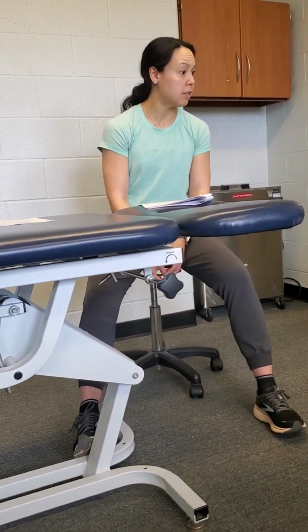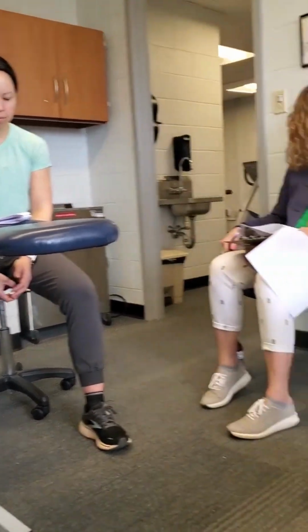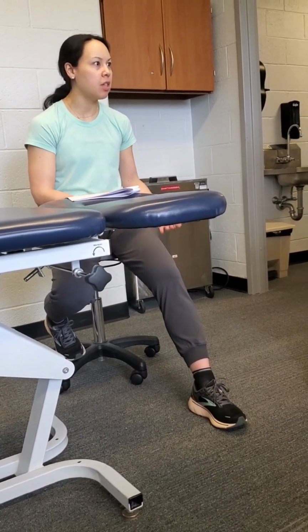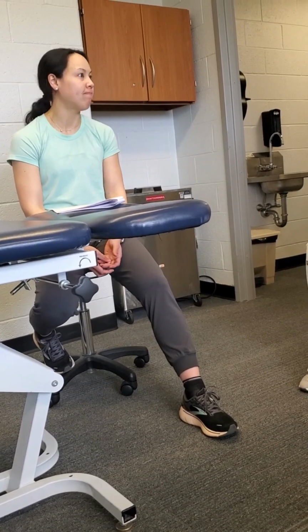I have a quick question. Yes. So, the passive BFR, the only thing I'm thinking is 2 days post-op there are incisions, right? And it says here to wait 2 weeks, but then a lot of this is saying do it at 2 days. So are they talking about the contralateral limb, or are they just doing it at 2 days? No, so that came up during the course, was like, what about the incision? Is the incision not healed by then? And generally, it's not an issue. Okay. It's not an issue at all.